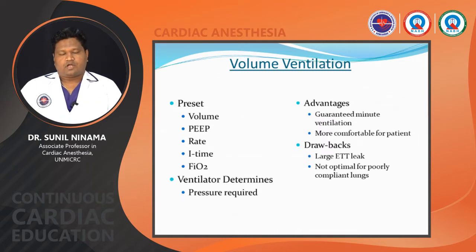Volume modes. When you keep the patient on volume ventilation, what you have to set on the ventilator is the tidal volume. You have to set the PEEP, the rate, the inspiratory time, and the FiO2. And what the ventilator determines is the pressure required for that volume. Advantages are guaranteed minute ventilation and more comfort for the patient. Drawbacks are a large endotracheal tube leak, and it is not optimal for poorly compliant lungs.